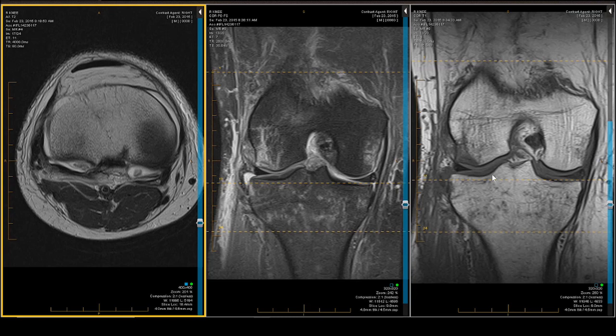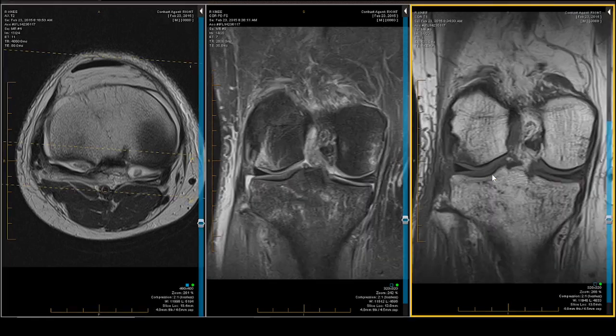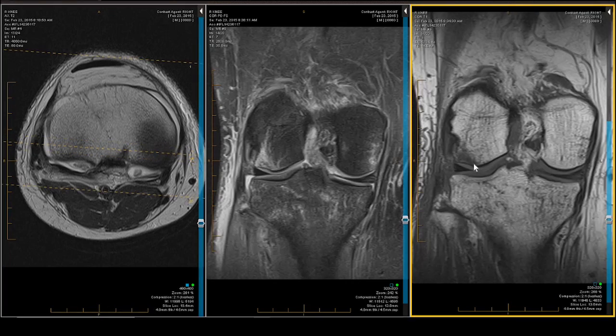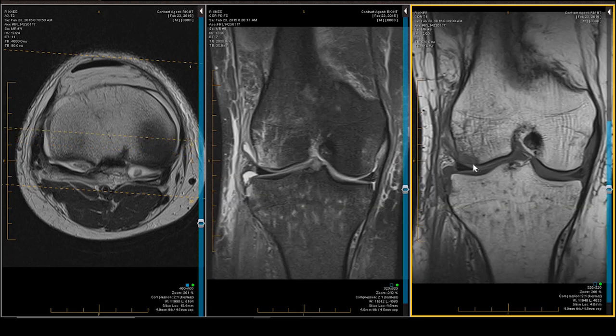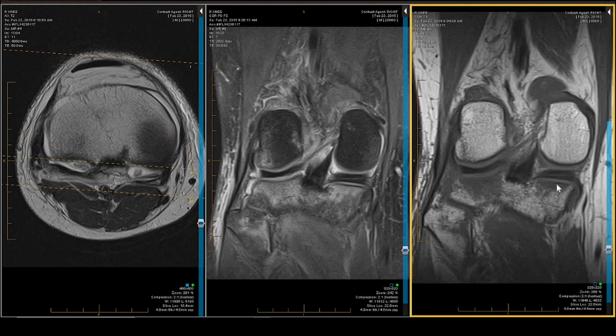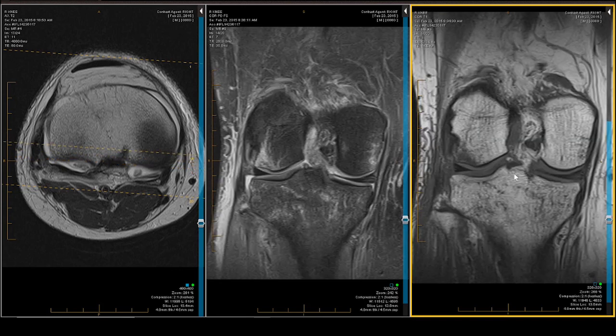Let's look at the coronal T1, because that's where you're going to get your best depiction of the fractures. There is a depressed fracture in the femoral terminal sulcus, and there are paired posteromedial and posterolateral fractures. This patient has had a component of a pivot shift — remember, he reported a twist.